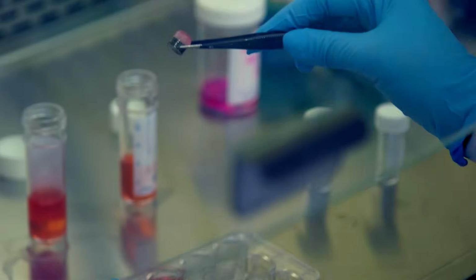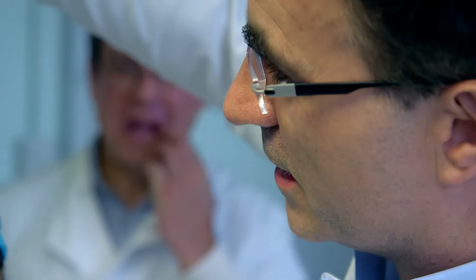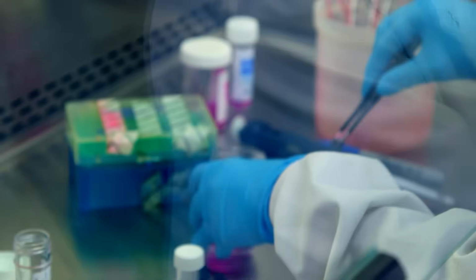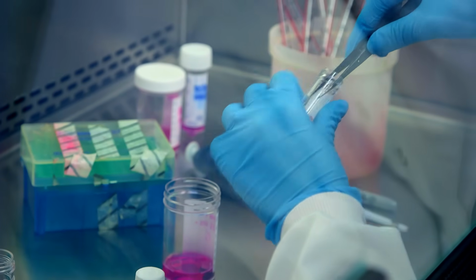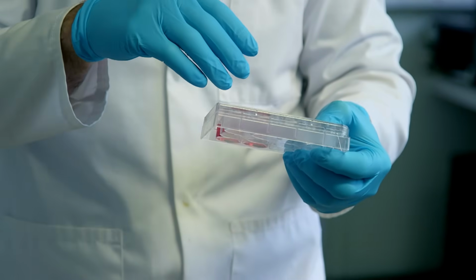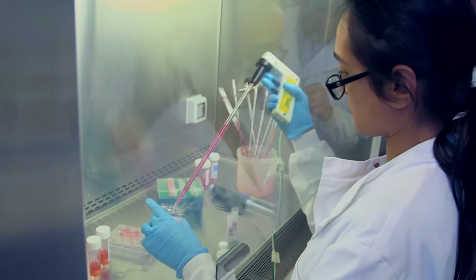In here is a little disc of honeycomb metal, a titanium structure that is almost the same as the honeycomb structure of bone. And on top of that, we've stuck, like Velcro, a layer of plastic fabric. The cells are injected into that so that they can attach their tentacles to the carpet and then resurface the joint. Now, I personally have never done this before, and to our knowledge, very few people in the world ever have. These things are also going to be used in humans, so the information that you'll get from Flo will be phenomenal and will be able to be used in other applications as well. So to save other dogs and to save other humans. Exactly. Nita, thank you so much. That's okay.